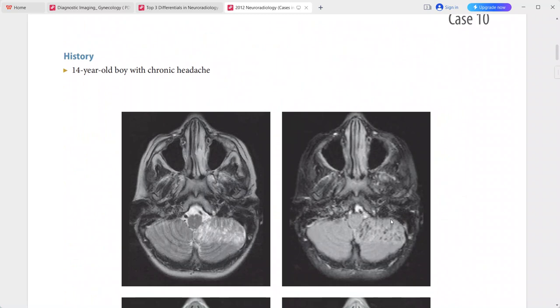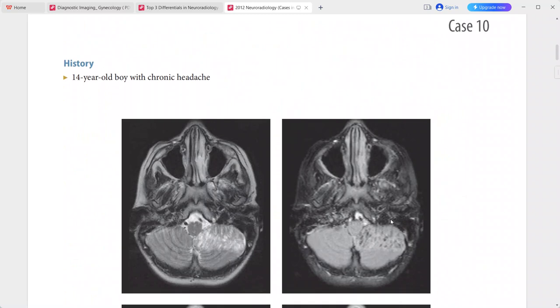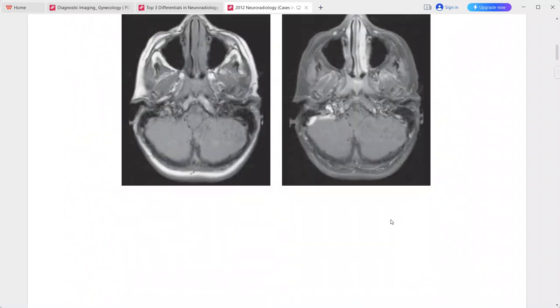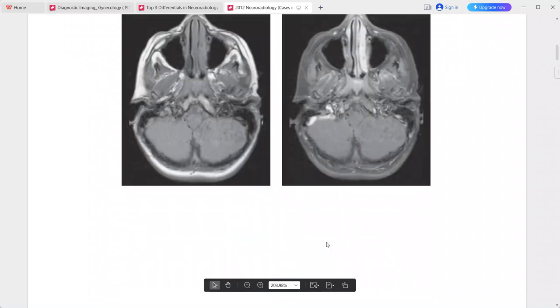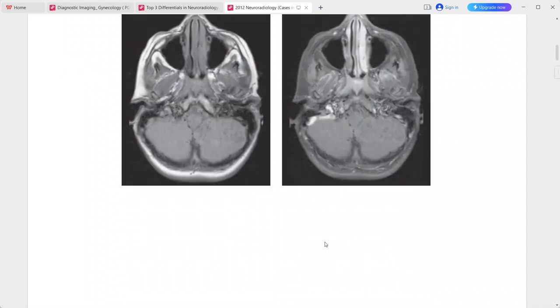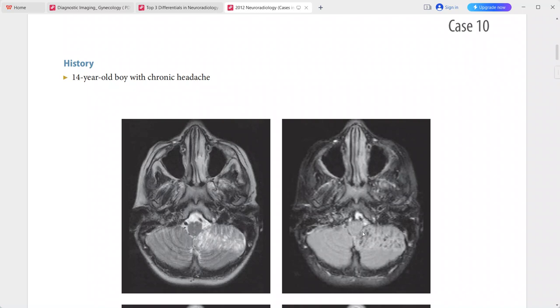Next case: 14-year-old boy with chronic headache. There is a lesion in the left cerebellar hemisphere which is hyperintense on T2-weighted images and iso- to hypointense on T1-weighted sequence.